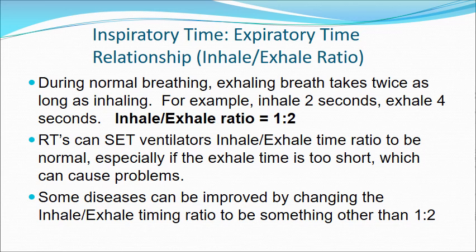Many times the way in which you set that ratio is indirect. For instance, on the LTV 950, you're allowed to set the inspiration time, and that in turn will determine the exhalation time based on mode of operation. So you'll be able to read that value, but you won't necessarily be able to alter it directly.